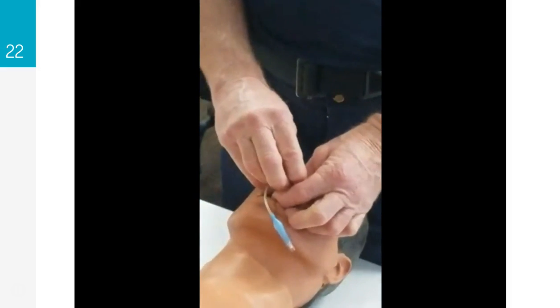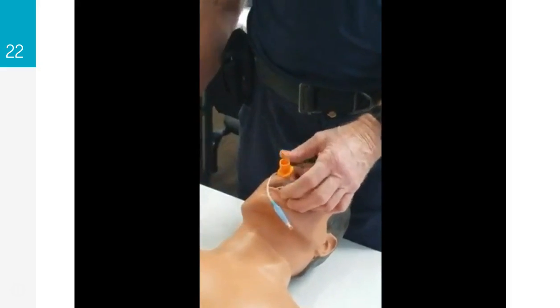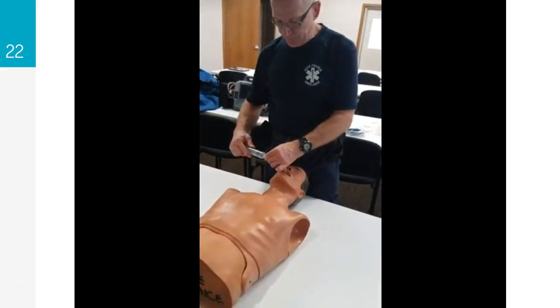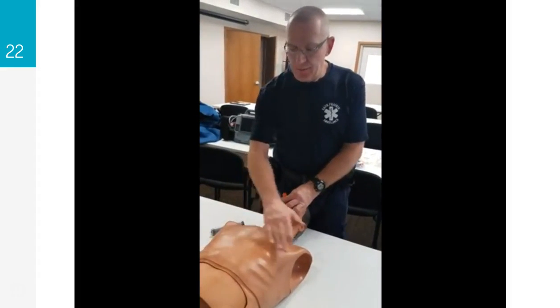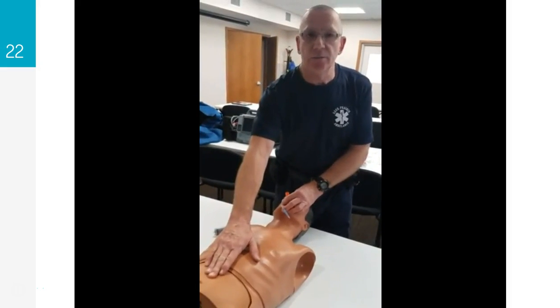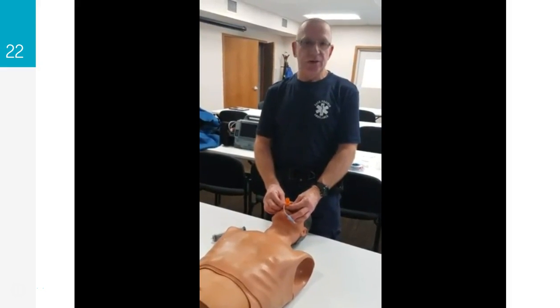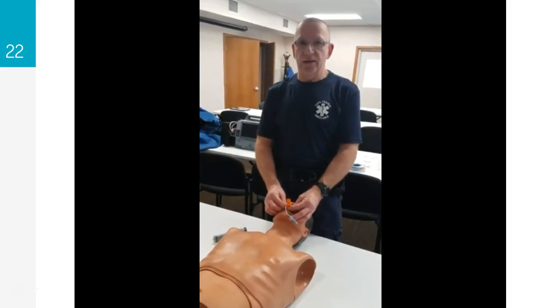And then we will attach our ambu bag and ventilate as we're slightly pulling out, and once we have adequate tidal volume and lung expansion, we will then insert another 10 cc's to seat it. We'll ventilate, check bilateral breath sounds. Apex is your best site, and then also check your belly sounds. Secure the King airway in place. There is a pediatric securing device in the airway kit, so you should secure it using that.